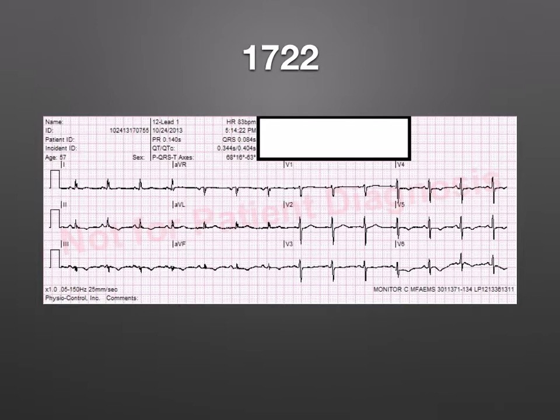And as another aside here, let's say that this patient had a right bundle branch block. Is this a code STEMI? And the distractor in question is no, because the elevation is from a right bundle branch block. All right, so that can't be the right answer because, again, there's no elevation. But even if there were, it wouldn't be the correct answer because a right bundle branch block doesn't cause ST segment elevation and is not an imposter. Therefore, that should never be the option.